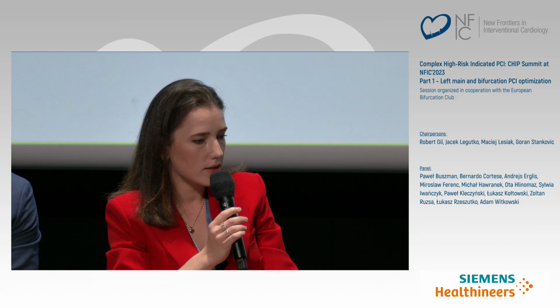I would like to congratulate on the case and the excellent results. I would like to underline the role of IVL in this case, especially in a lesion where the diameter of the artery is quite large and rotablation is not enough for this type of lesion. We observe that type of lesion very often, especially in the left main, and we are thinking how to modify the lesion.